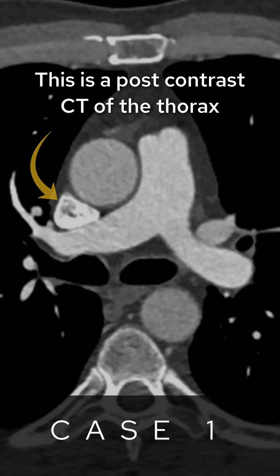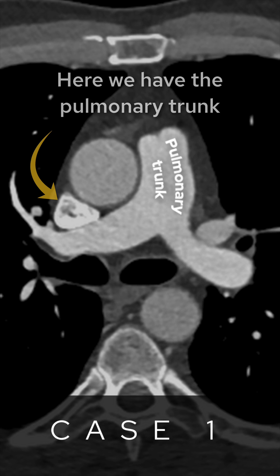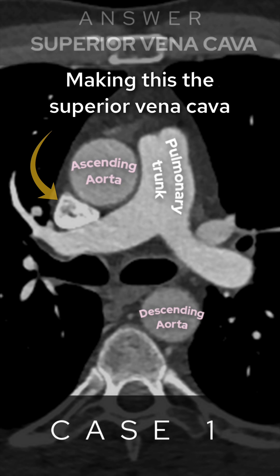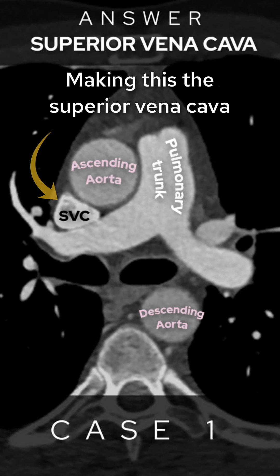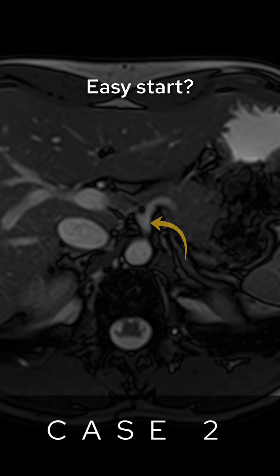This is a post-contrast CT of the thorax and we're looking at the mediastinum. Here we have the pulmonary trunk, ascending and descending aorta — making this the superior vena cava, or SVC, making its way to the right atrium. Easy start.